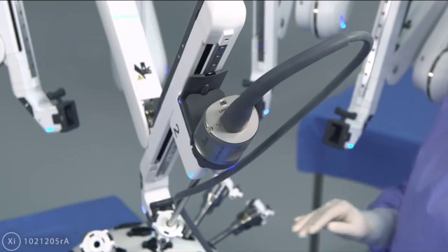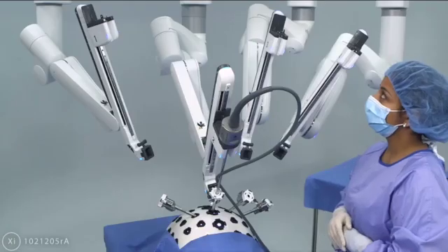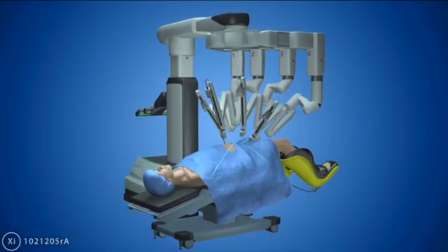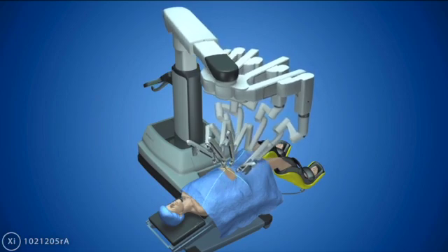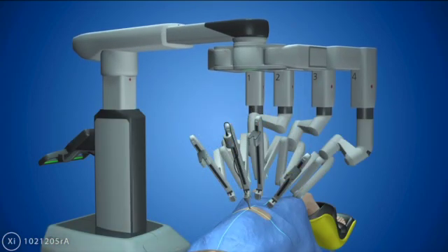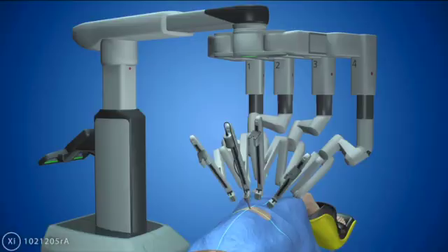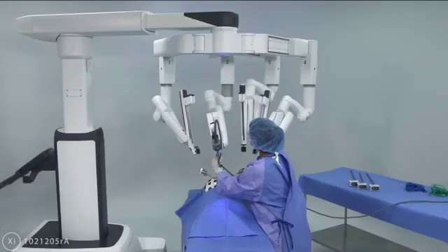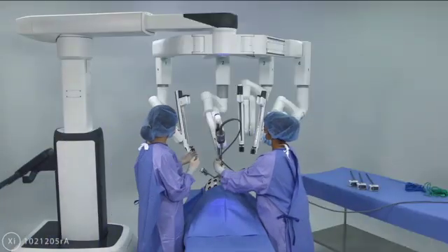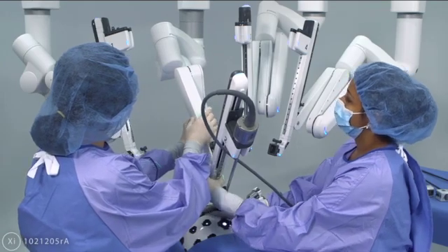Targeting complete. Connect the rest of the arms. Do not move the operating table while cannulas are connected. The boom may pivot, rotate, and adjust its vertical position. You will hear audible feedback as the boom adjusts and a double chime when the movement is complete. A sterile staff member then stabilizes the endoscope cannula at the patient's body wall and adjusts the flex joint of the endoscope arm to bring the arm in line with target anatomy.